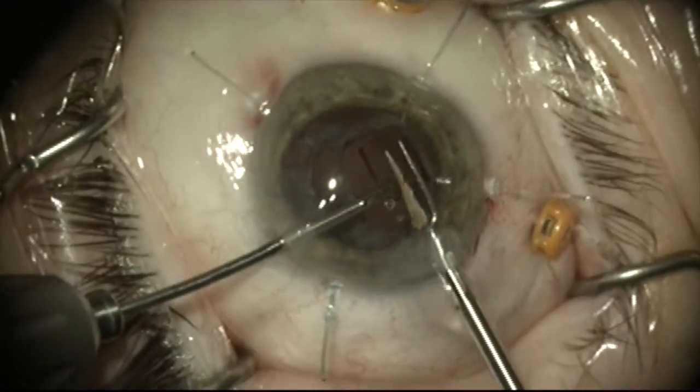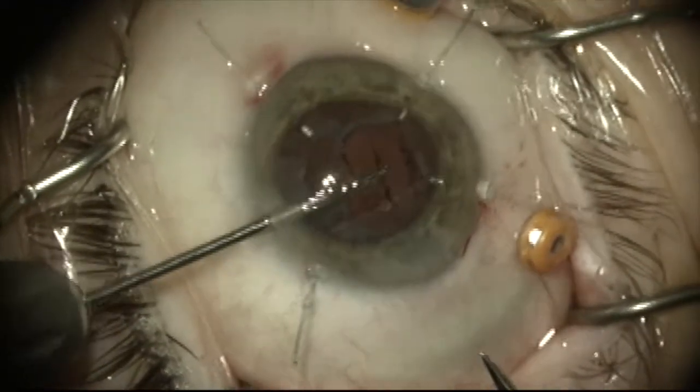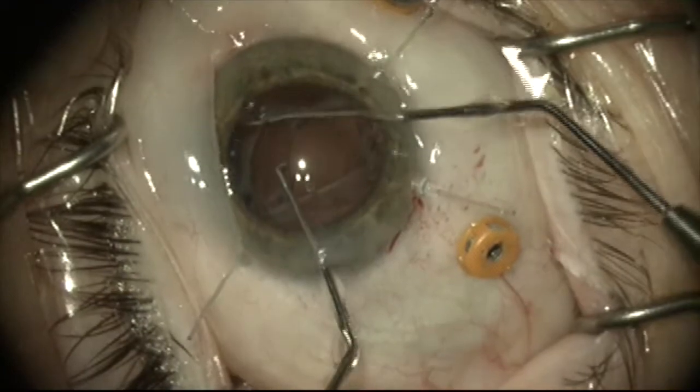The optic is removed. I'm going to trim the plates. I've grabbed the remaining plate here and I'm putting a little tension on it and cutting with the Packer-Chang micro scissor and pulling out this remnant.